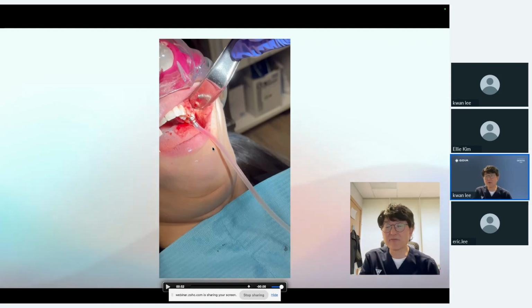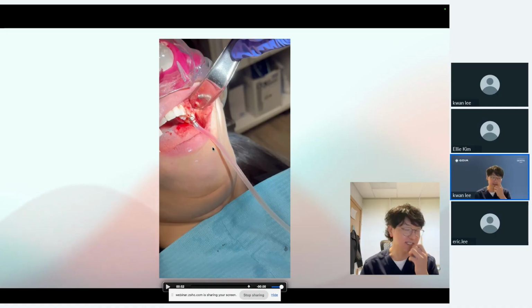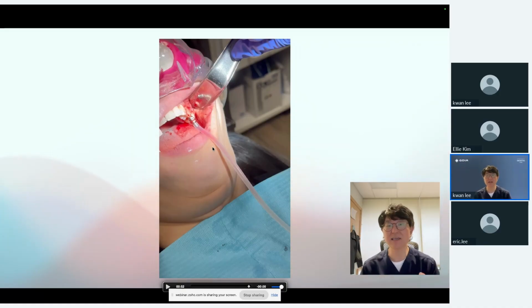With the conventional sinus augmentation, you just make a tiny hole osteotomy and push the bone, like half cc, 1 cc, and then you take the film, and how much this is elevating we have no idea. But with this technique, I have a calculated amount of saline, the hydraulics, so that way I can calculate how much I can elevate the Schneiderian membrane here.